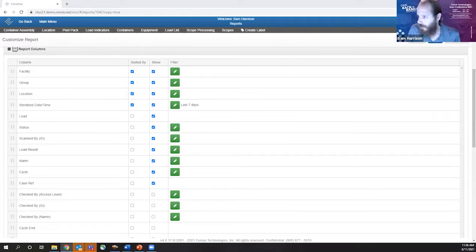So let's just keep going down the list here. We got about 10 more minutes. I'll try to go through some of these a little bit quicker.